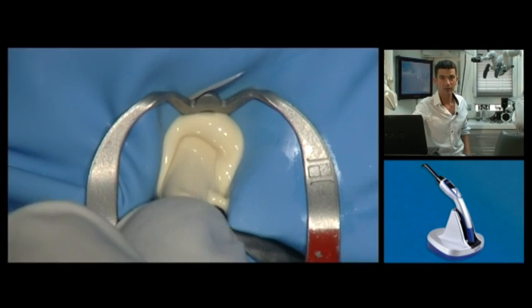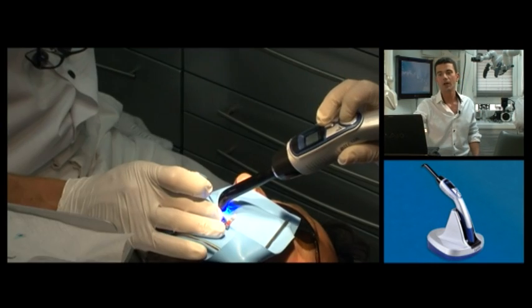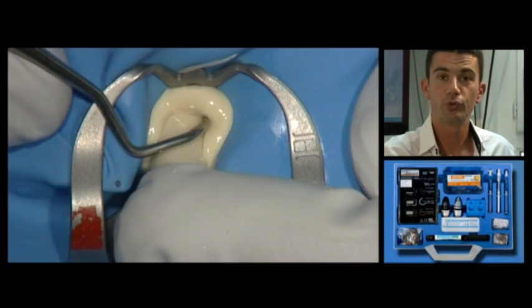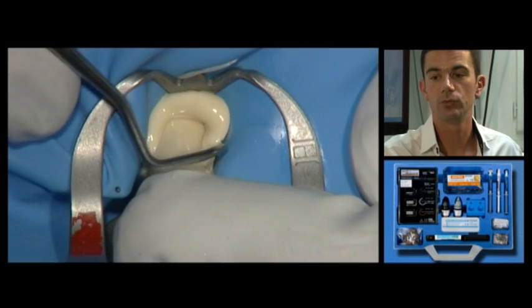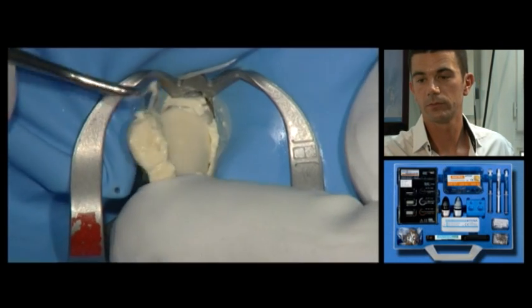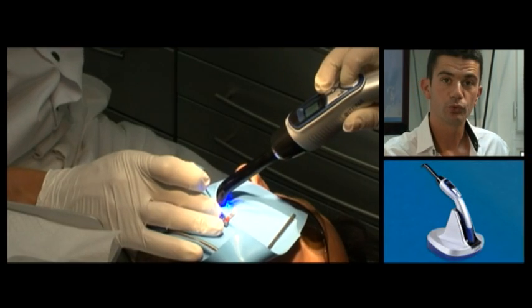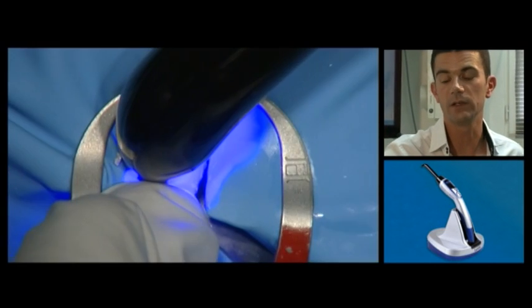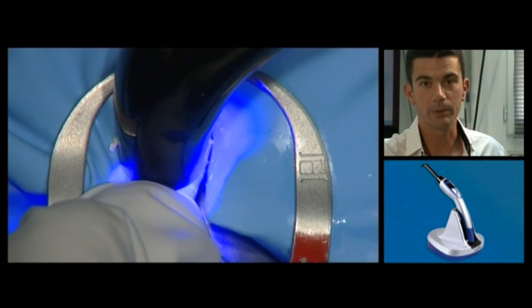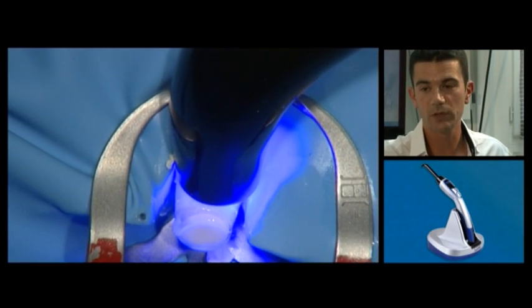At this stage, a few seconds of light curing will set any excess composite for ease of removal. While still plastic, the excess can easily be removed with a curette. Then the composite is fully and completely light cured. This is a dual-set material: the outer surfaces will set by light curing and within the canal, curing will of course be completed by the self-curing stage.